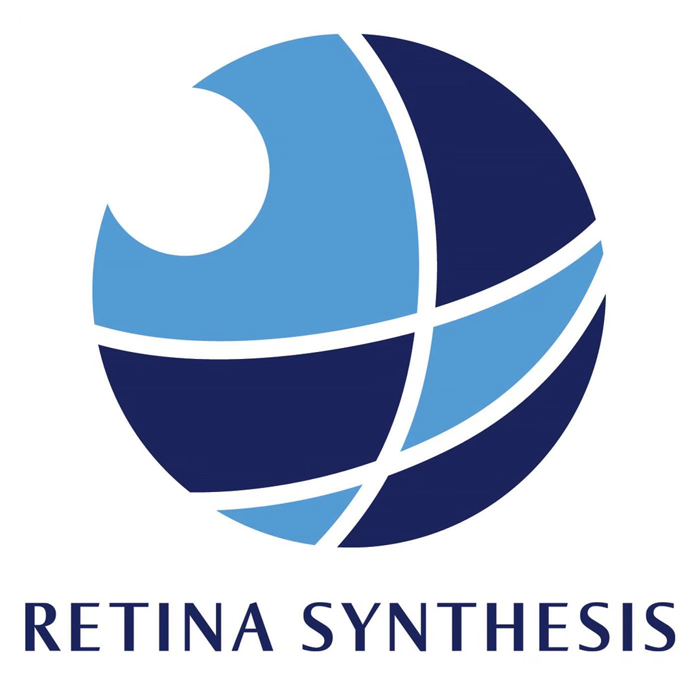So one of the challenges that a number of groups have faced is quantifying this hyperpigmentation, because there are dots you can see on individual B scans. And when you look at them en face, you see a bunch of dots in the retina, but there's not only hyperpigmentation along the RPE, but also in the outer retina. And we published on that this past year.